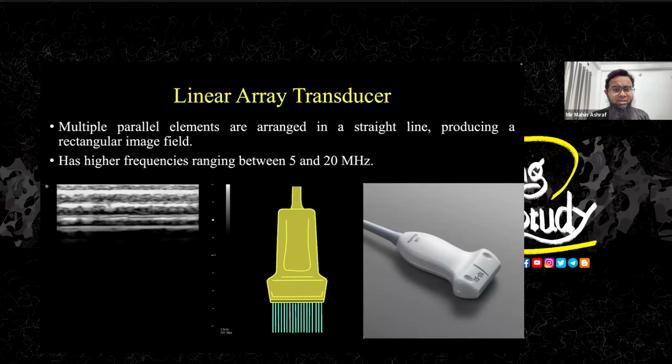Now, it has a big range of frequencies available in the market, like 5 to 12, 12 to 16, 18, or 15 to 20, many different ranges and many different types. So it has a flat footprint or flat surface, so it produces sound like straight parallel lines.